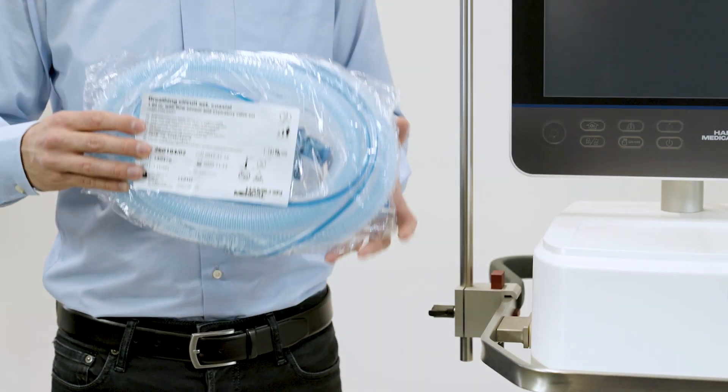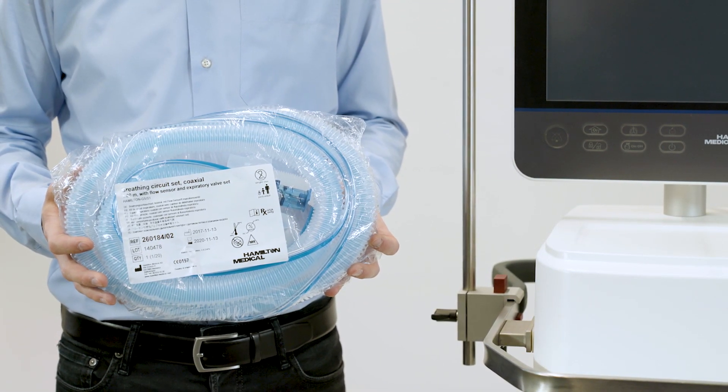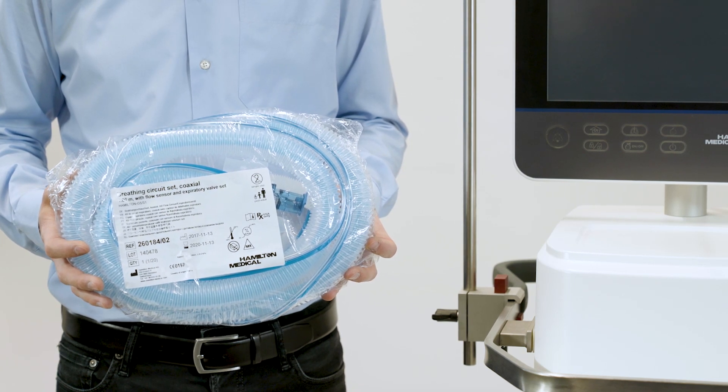If you are using a pre-assembled coaxial breathing set, this contains everything you need: the expiratory valve set, the breathing circuit, and the flow sensor.